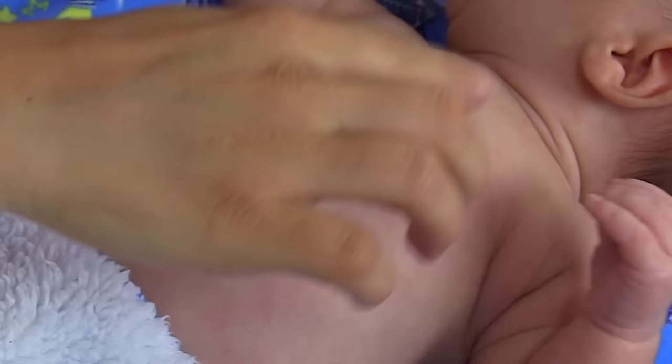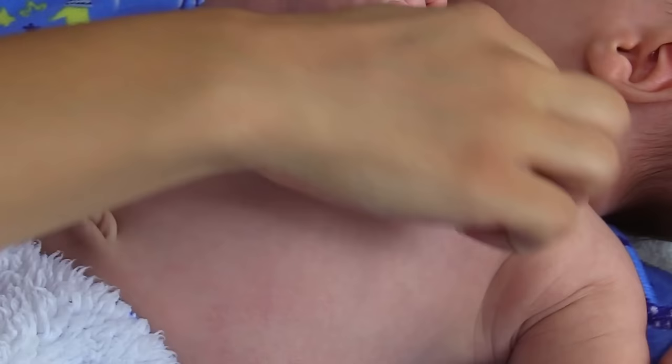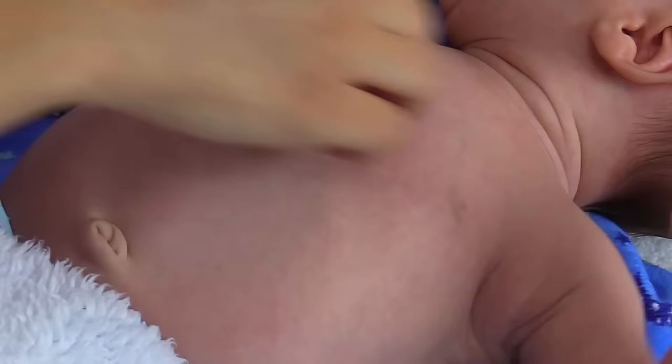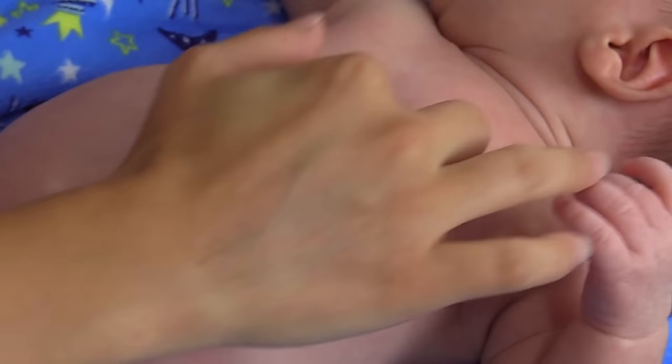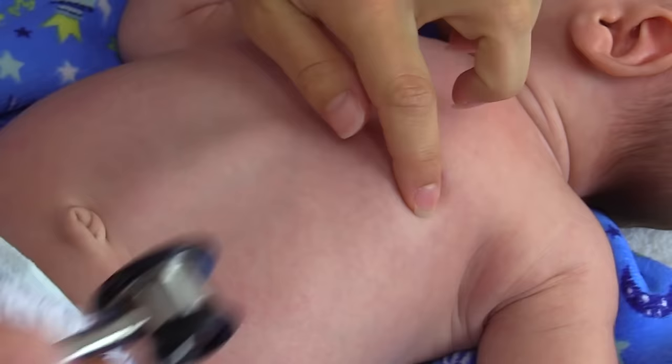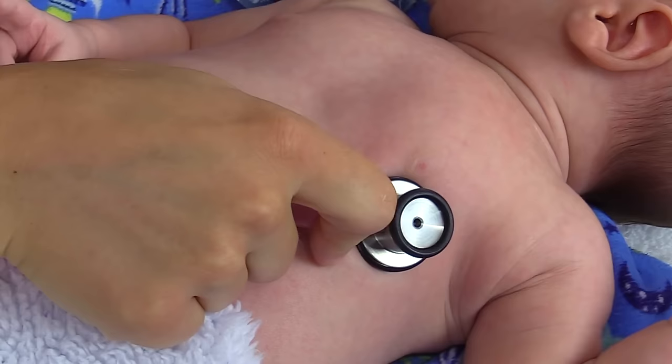To find the apical pulse, you want to find the fourth intercostal space. On an adult it was the fifth intercostal space at the midclavicular line, but for an infant it's at the fourth intercostal space, lateral to the midclavicular line. You want to find the clavicle and the breastbone, then go down and feel between the ribs to the fourth space — one, two, three, four — and then go just lateral to the midclavicular line. This is about where the apical pulse is on our infant, and we're going to place our stethoscope there and listen for one full minute.